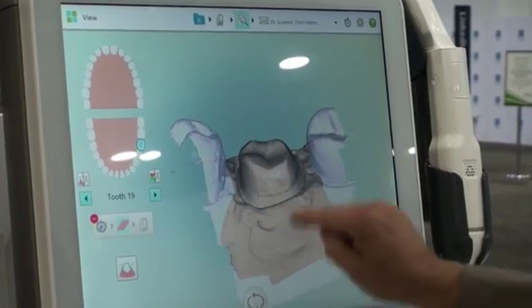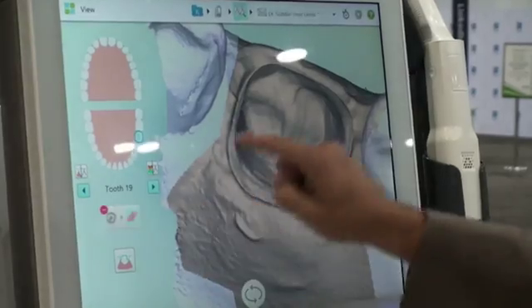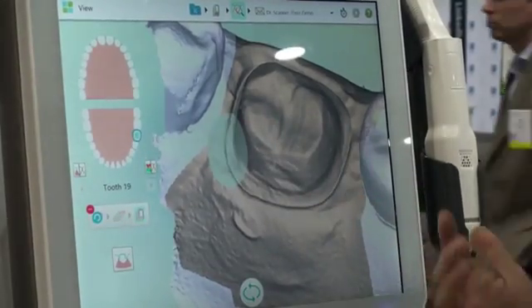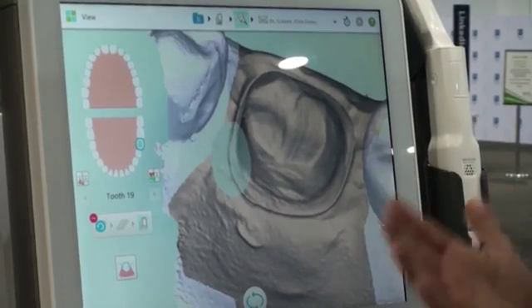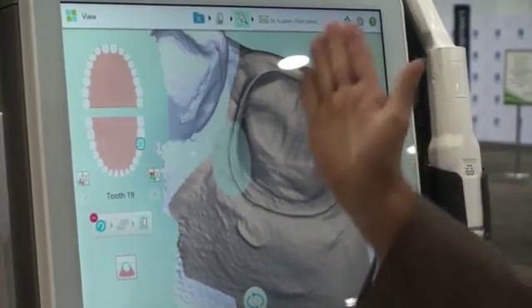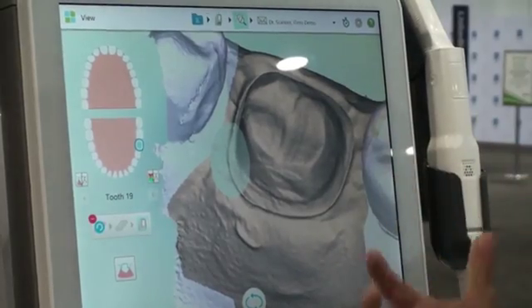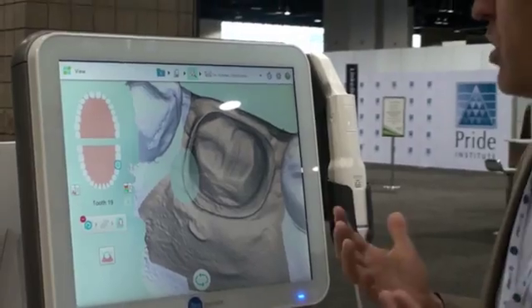I also like it for margins. If I have an area that's not clear, I can go ahead and erase just a specific area on the margin, go back and pack cord again or use a hemostatic agent if I have some bleeding, and then go back and scan just that one area to clear it up. Just a couple of great features that I find extremely accurate.